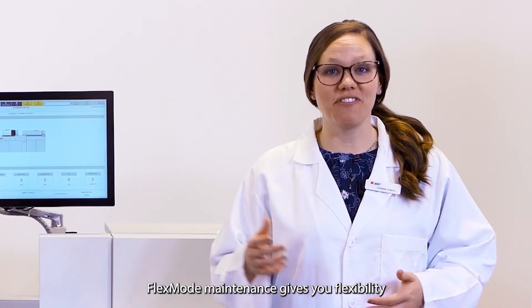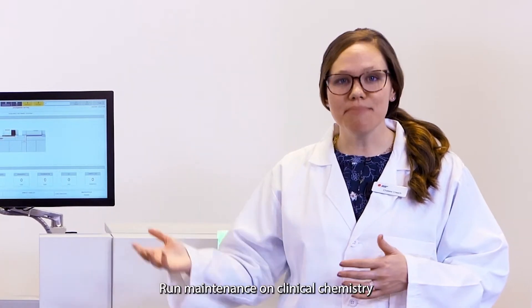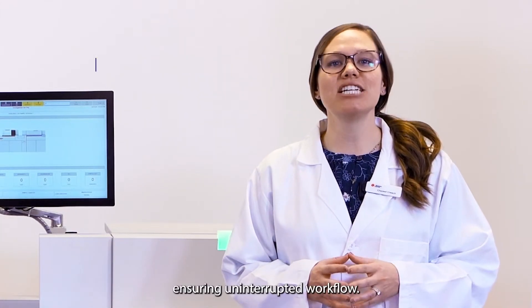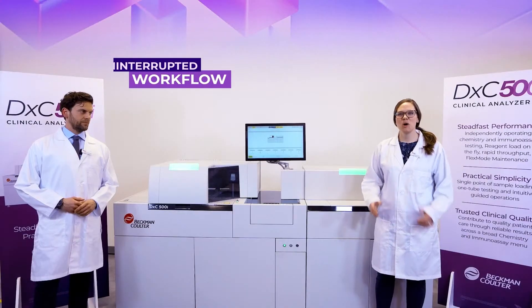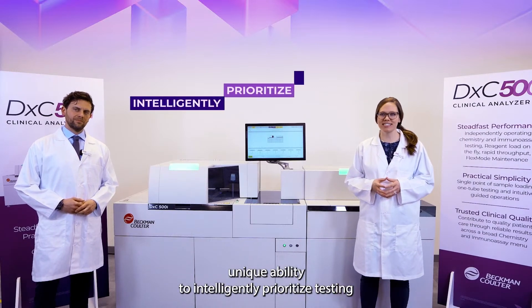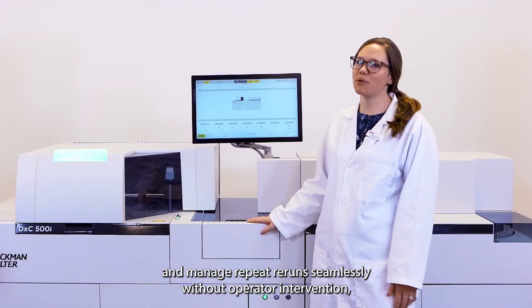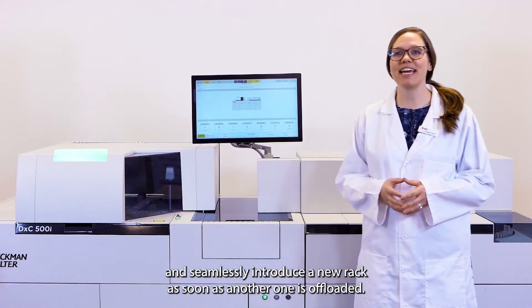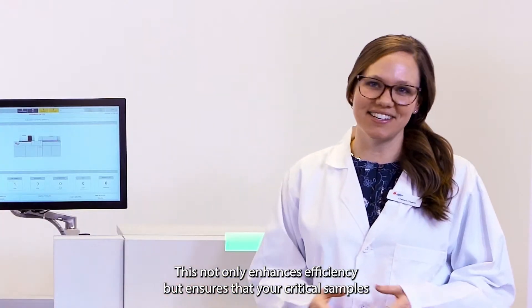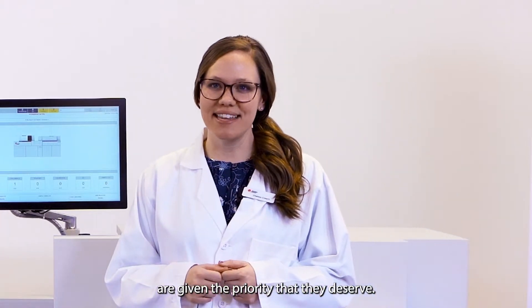FlexMode Maintenance gives you flexibility and control over your schedule. Run maintenance on clinical chemistry while running immunoassay testing and vice versa, ensuring uninterrupted workflow. What also sets FlexMode apart is its unique ability to intelligently prioritize testing and manage repeat reruns seamlessly without operator intervention, and seamlessly introduce a new rack as soon as another one is offloaded, ensuring that your critical samples are given the priority that they deserve.